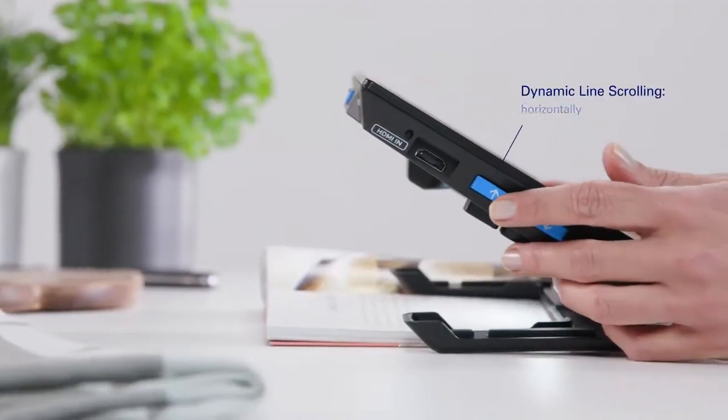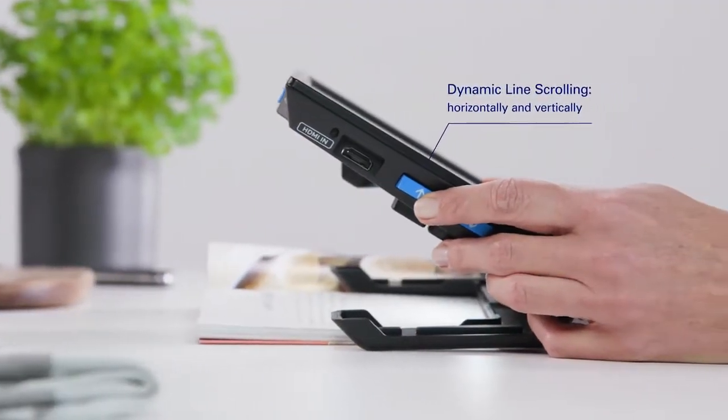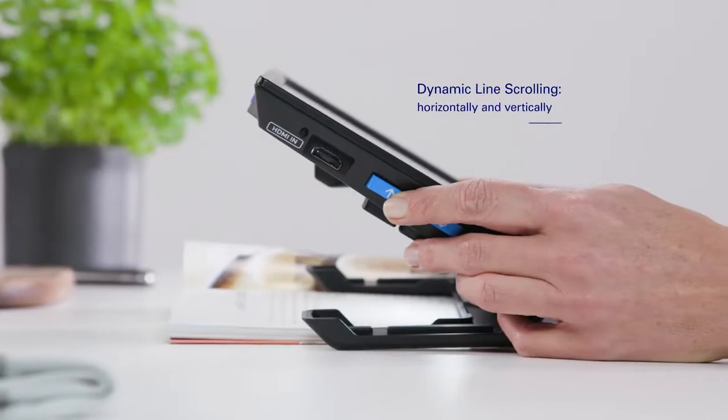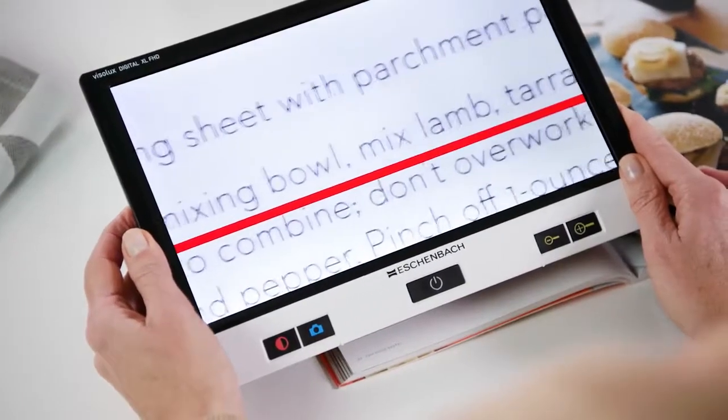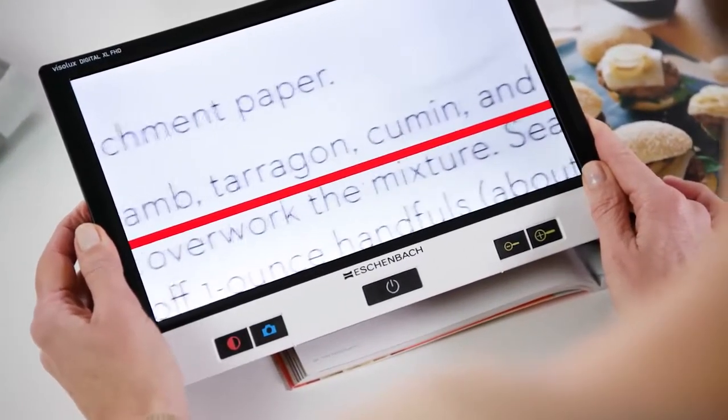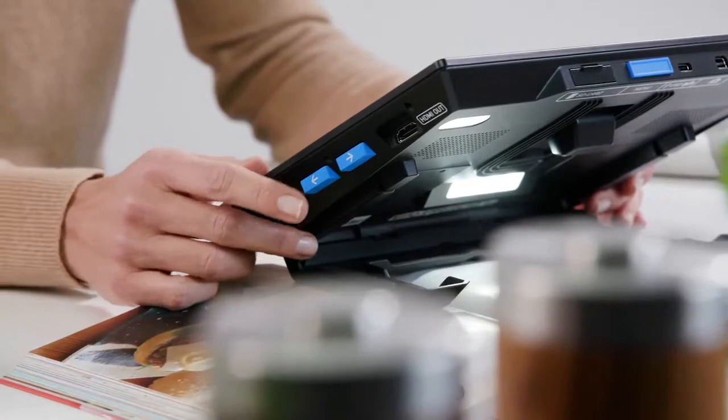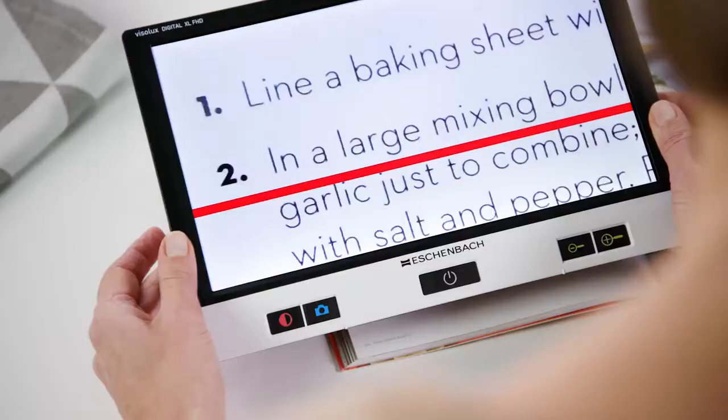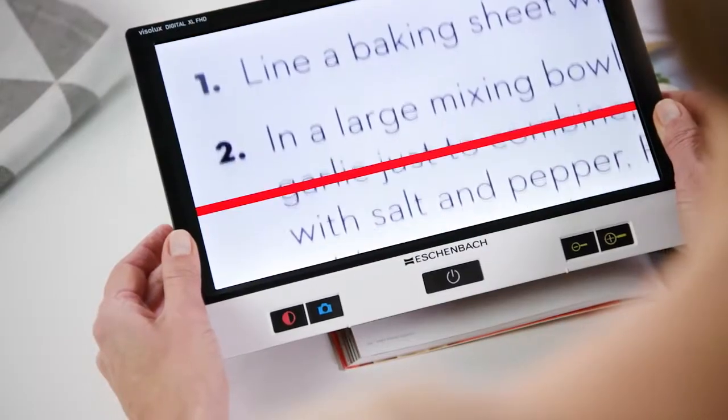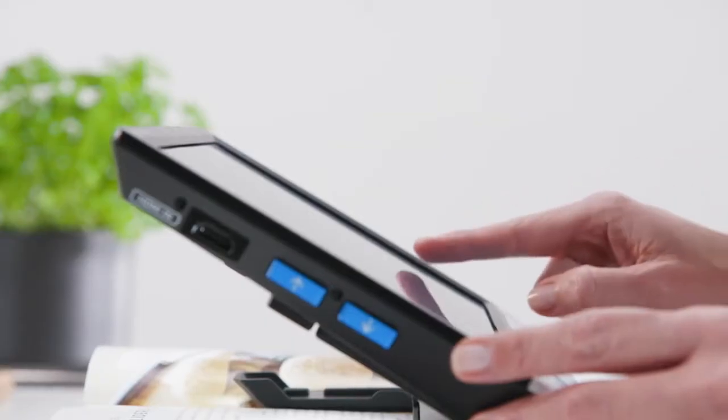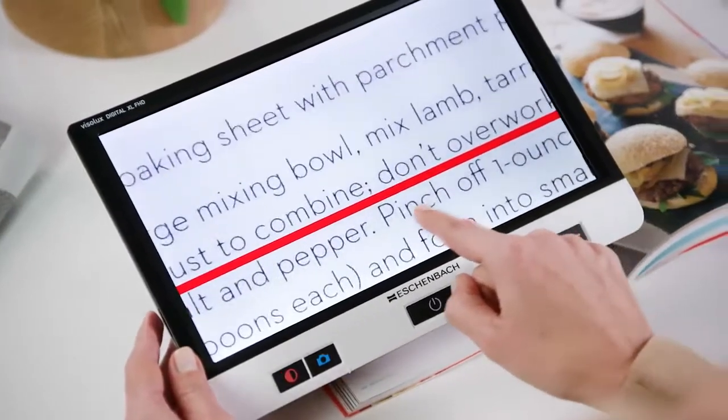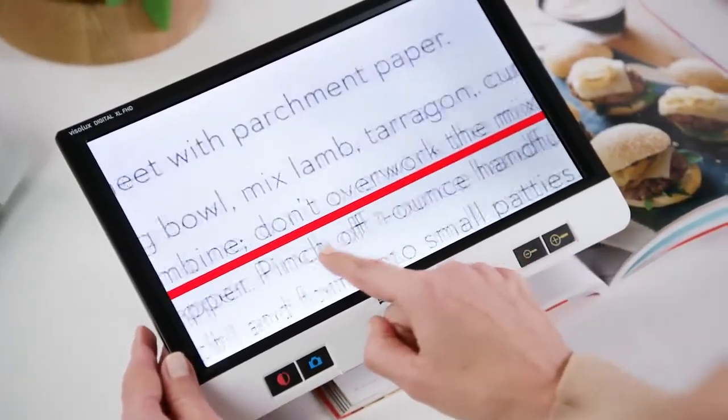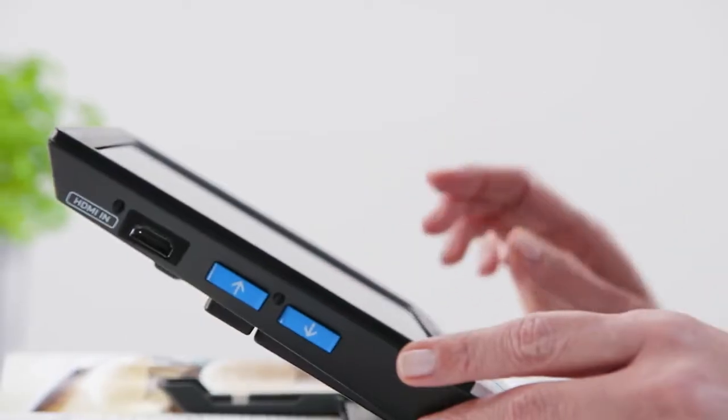Use dynamic line scrolling via the touch screen or the operating buttons on both sides of the device. It allows you to move the image section horizontally and vertically without you having to move the device itself. And even at high magnifications, you will always be able to orientate yourself on the screen.